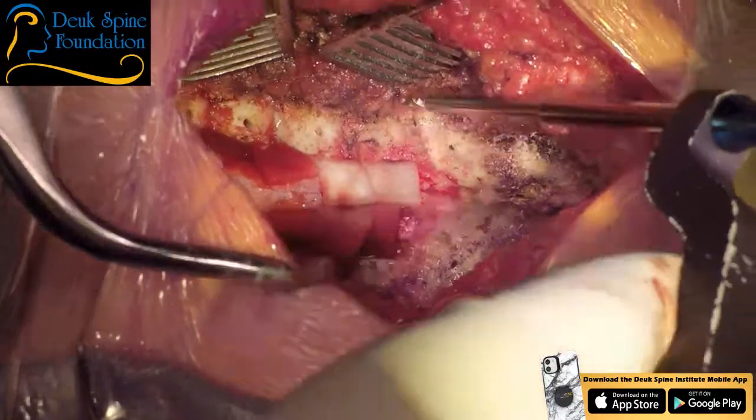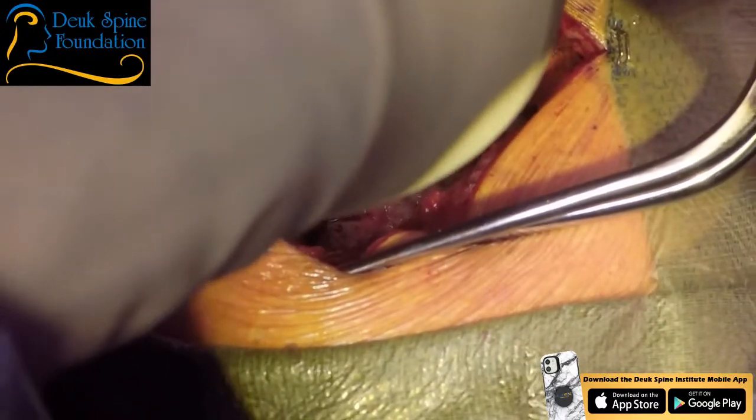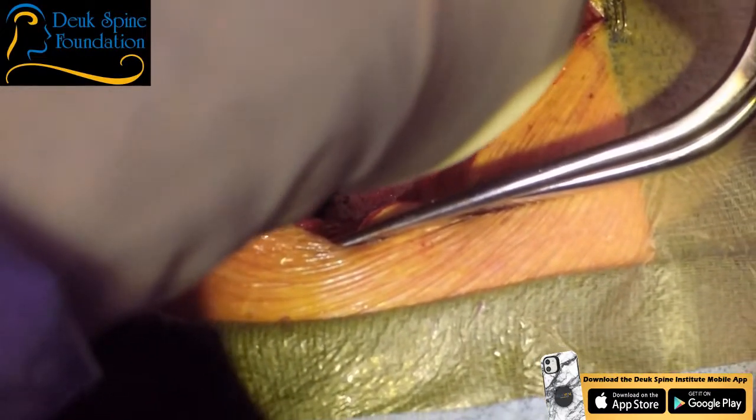See, this is rotated a bit too, C7. Some surgeons don't put a C7 lateral mass screw. I always do. I don't see any reason not to.